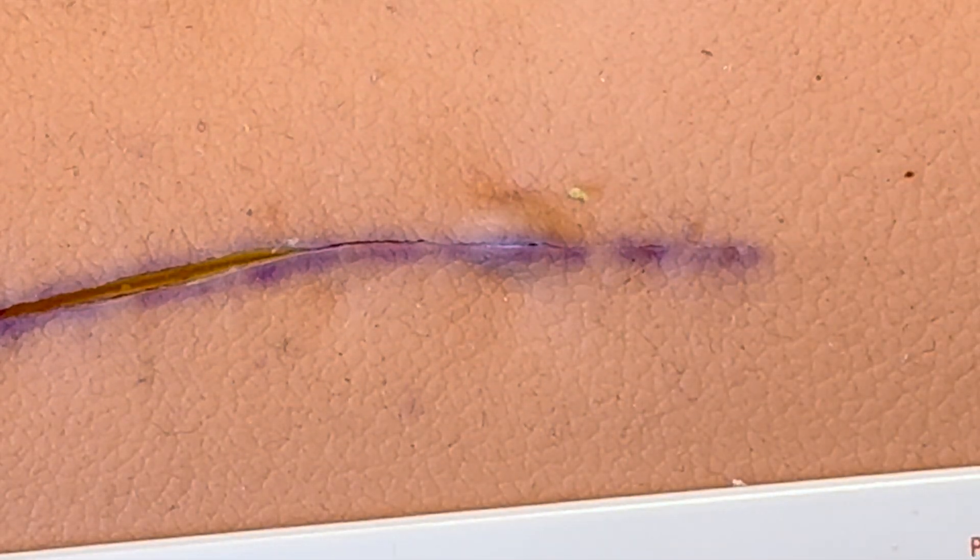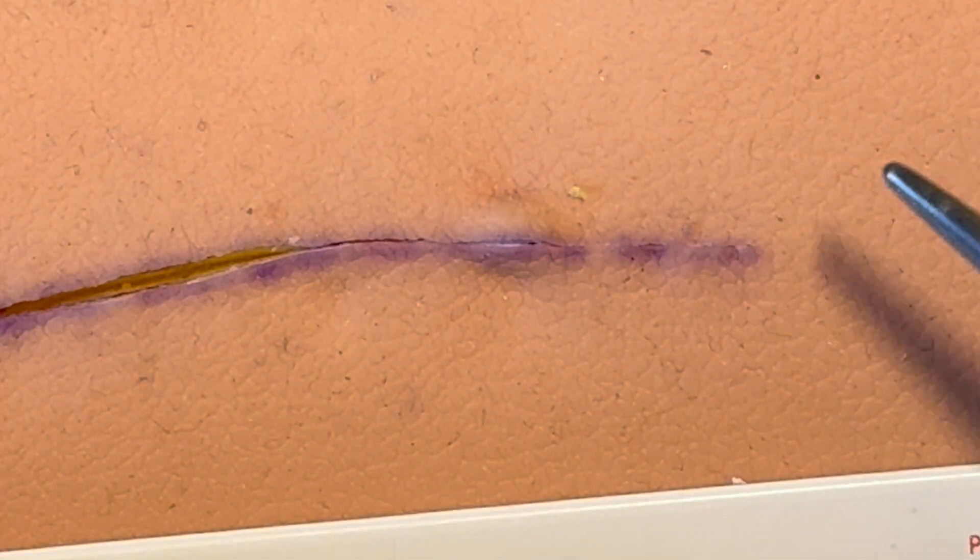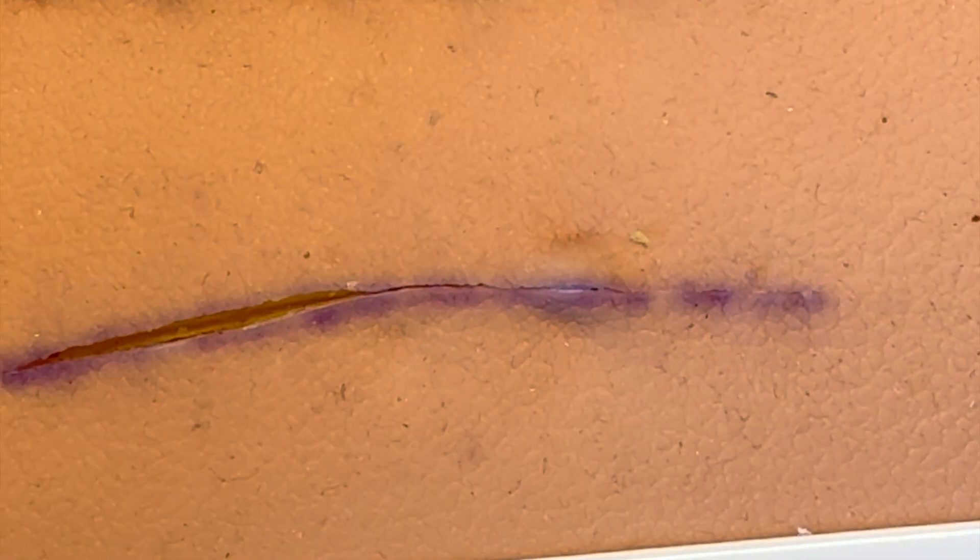We've just got much nicer dimples now — lift that up so you can see the nice dimples. That's really what you want, but you need to tell the patient that this is expected and deliberate. They might think it looks terrible, so tell them it's temporary, that those dimples are intentional, and that it will go away as the suture material absorbs and everything flattens out nicely.